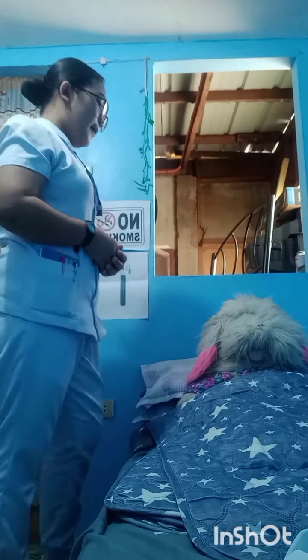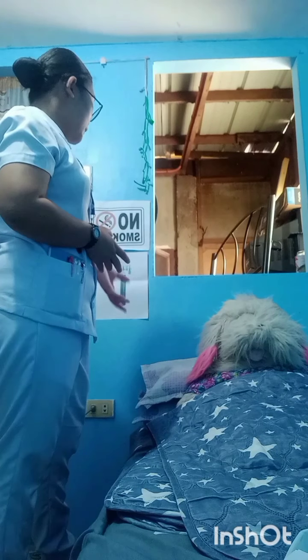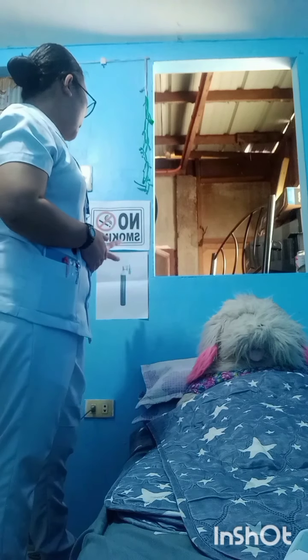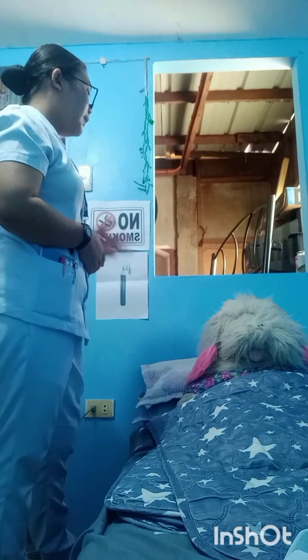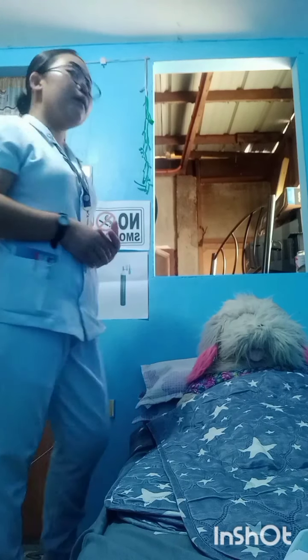So we're going to assure them that there is no hazard or bad side effect of having oxygen therapy. Ma'am, I will give you oxygen administration. This oxygen will not harm your lungs, it is okay, because it will help you breathe and you will be able to breathe better.